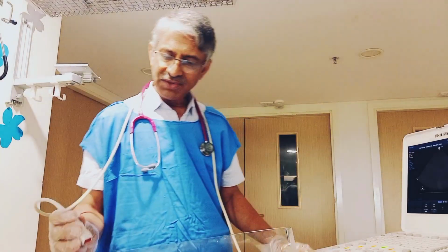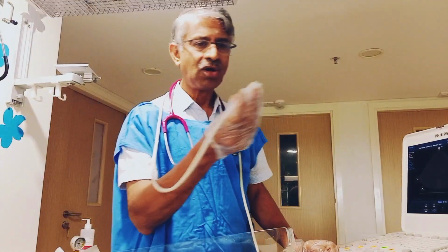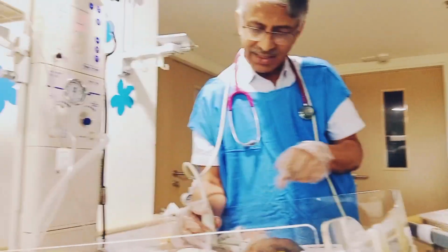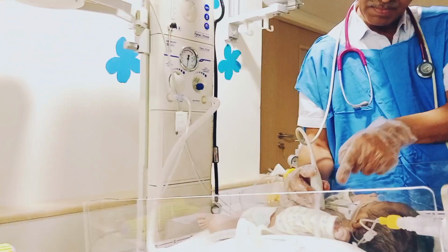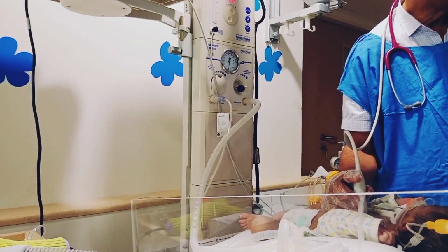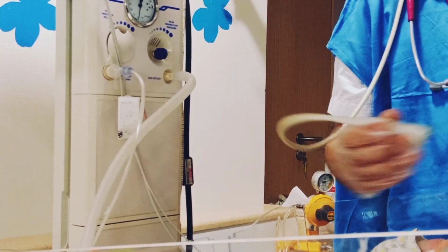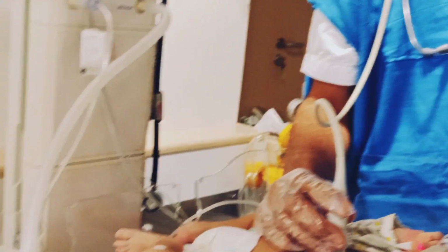So what I will do is the parasternal long axis, as all of us know how to keep. This is the window, the second intercostal space. I am keeping the probe parallel to the sternum on the left side with the marker facing to the... I'll just keep this one. So the marker. Yeah. Can you see that?